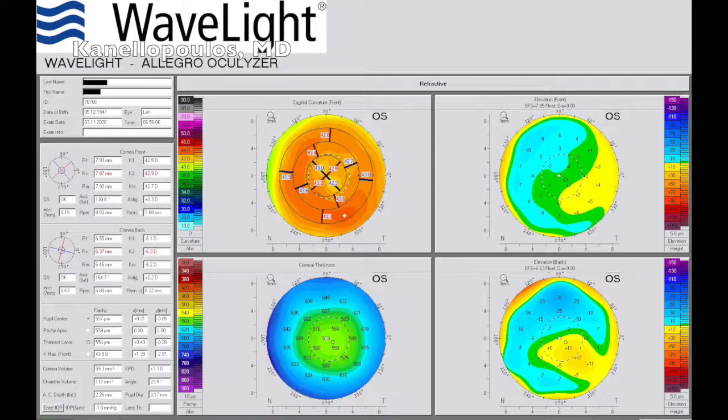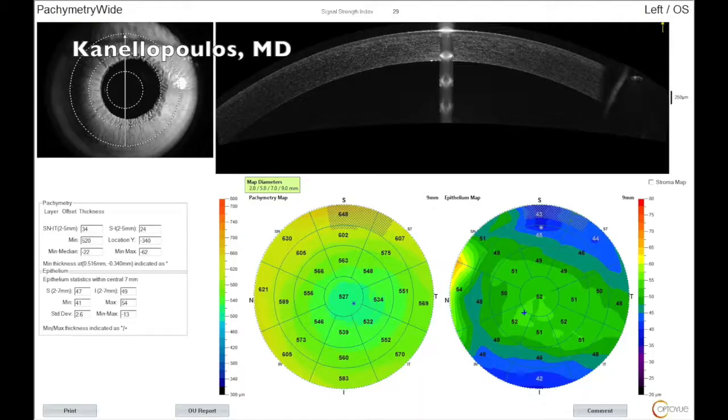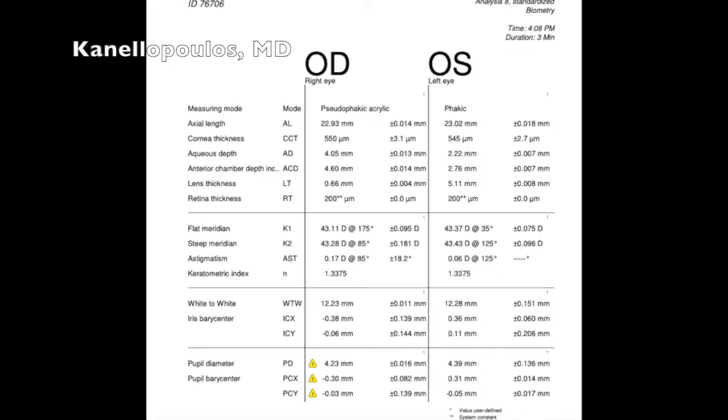We can see here on the wide field fundus view how cloudy the left eye is. Of course, all keratometric evaluations — we see Pentacam maps here of the anterior segment. Avanti OCT shows the thickness maps and the epithelial distribution. We are scouting for keratoconus everywhere in all of our patients.